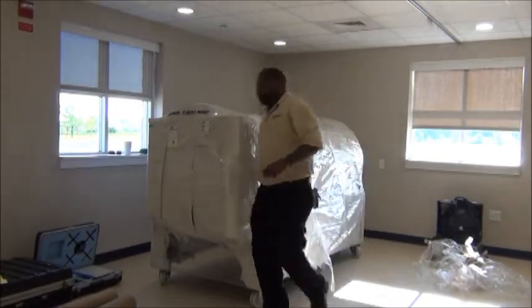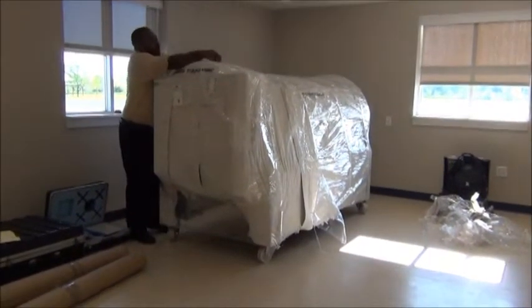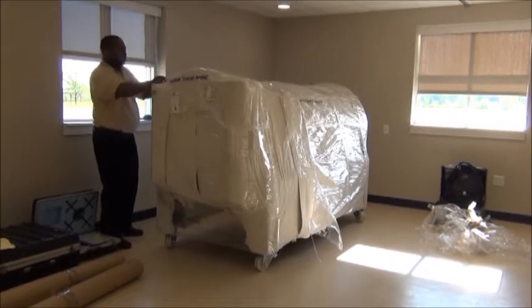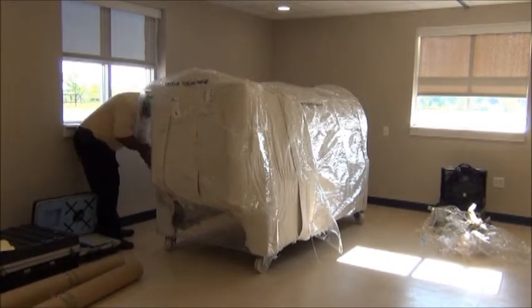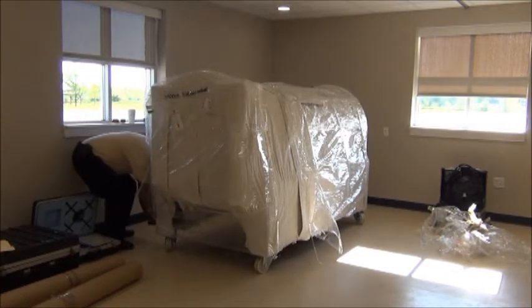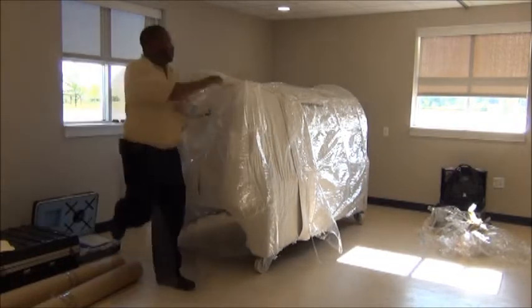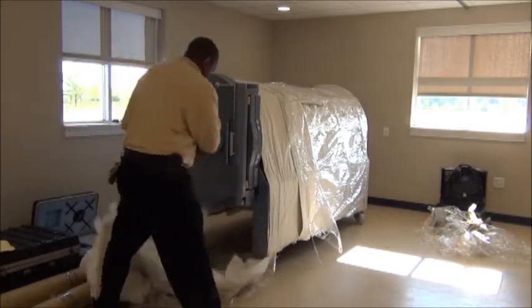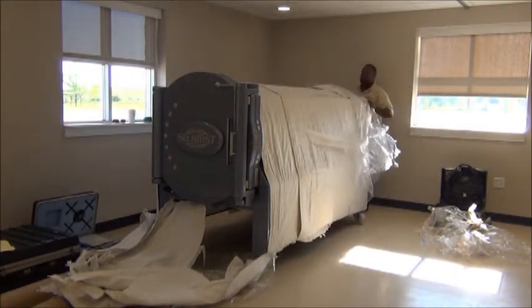The reason for Huron Medical Center's new acquisition was twofold. First, the closest hyperbaric treatment centers are in Saginaw and Port Huron. The period over which treatment must be followed also compounded the distance issue. Treatments generally are 90 minutes, and that's once you're at depth. And treatments are every day, 5 times a week, for up to, however long the doctor wants, but until we feel that the progress cannot be made anymore.